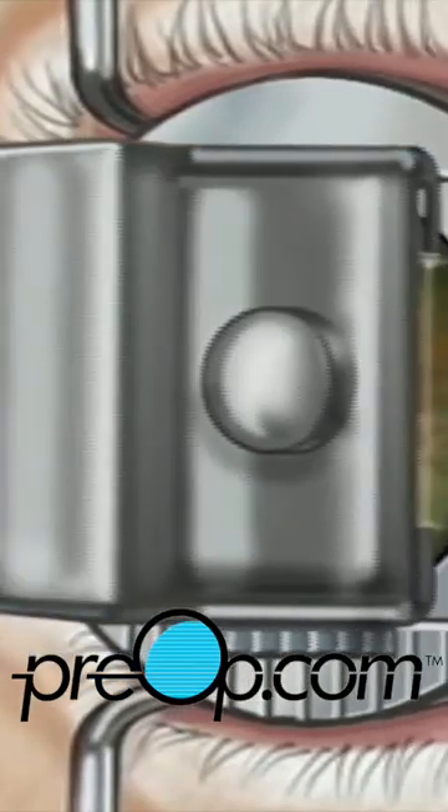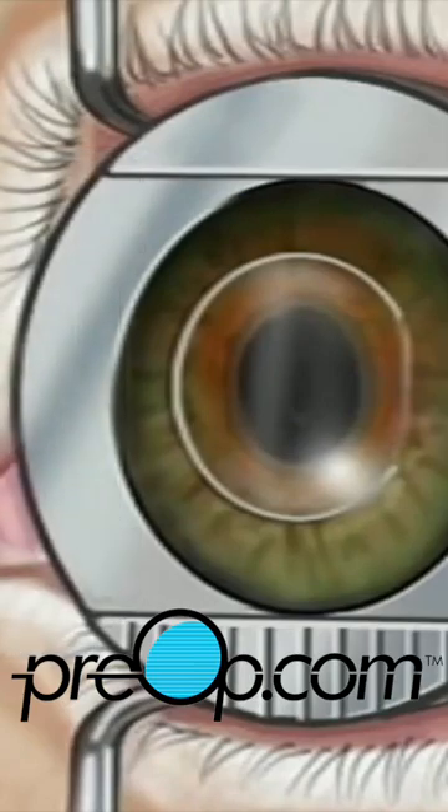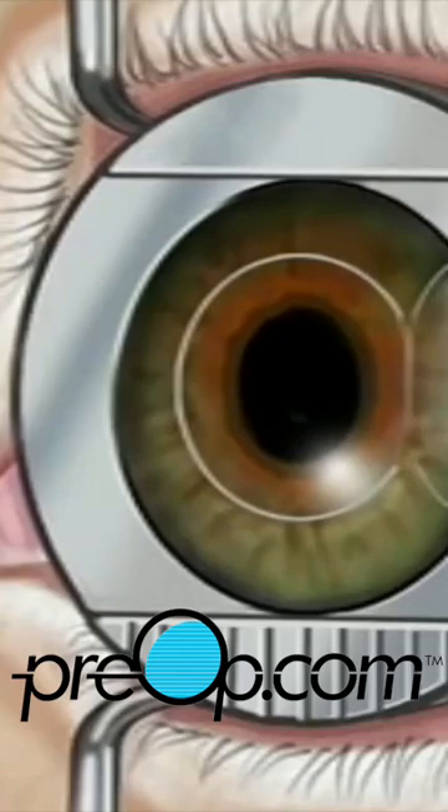A thin corneal flap, which remains hinged to the eye. Underneath this flap, the inner layer of the cornea, called the stroma, is exposed.